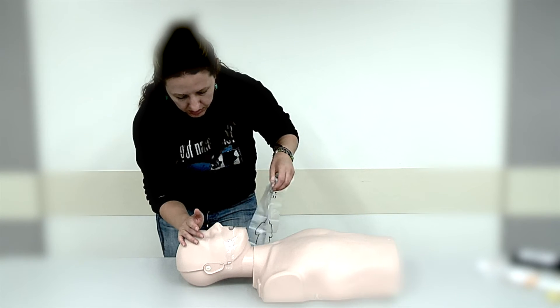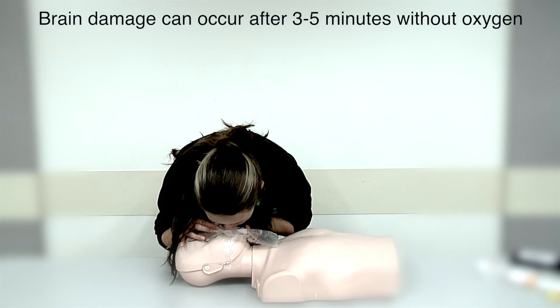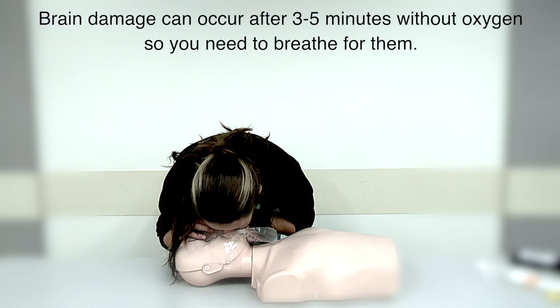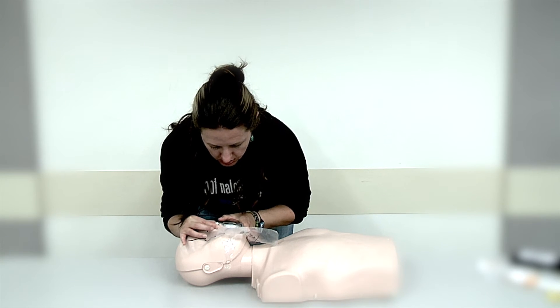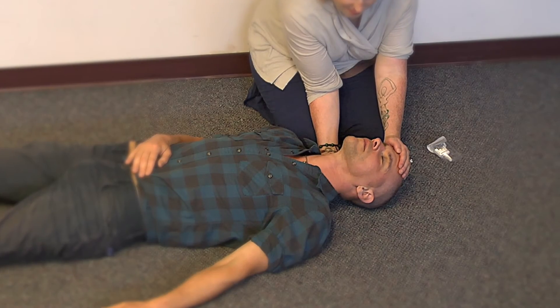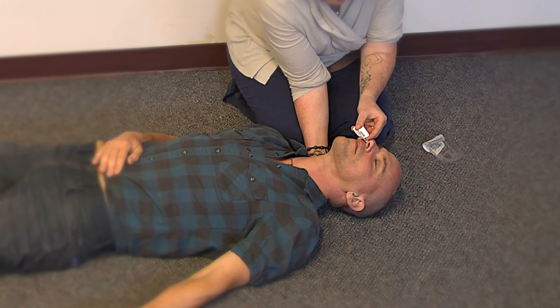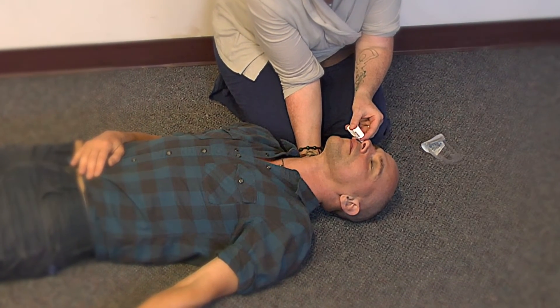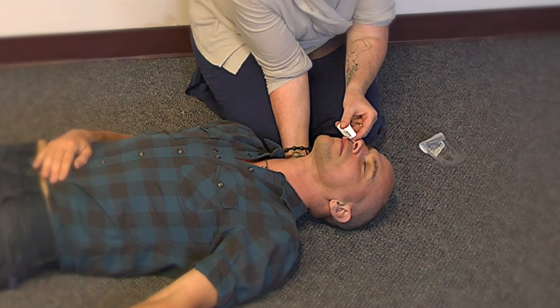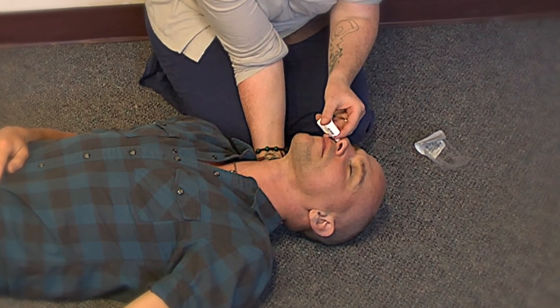Step 5: Give more rescue breathing. It may take several minutes for the Naloxone to kick in. Brain damage can occur after 3 to 5 minutes without oxygen, so you need to breathe for the person until the Naloxone kicks in. Give one breath every 5 seconds. If the person has not woken up after 3 minutes, give them a second full 4 mg dose of Naloxone. Continue breathing one breath every 5 seconds until they wake up or until emergency medical services arrive.